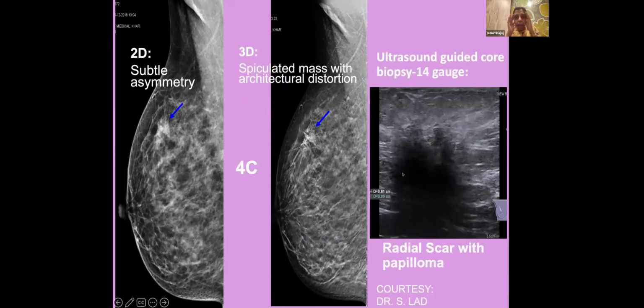No, because we know, and in our minds, we have certain pictures: radial scar, diabetic mastopathy, a lot of dense fibrosis. These are what those lesions are going to look like. We will give it a 4C, but when it comes back, you can accept it as a concordant result and just do a benign biopsy follow-up, which we do for every lesion that we biopsy. Even if we get a benign biopsy result, we still follow it up at 6 months, at least once, the same lesion. Okay.